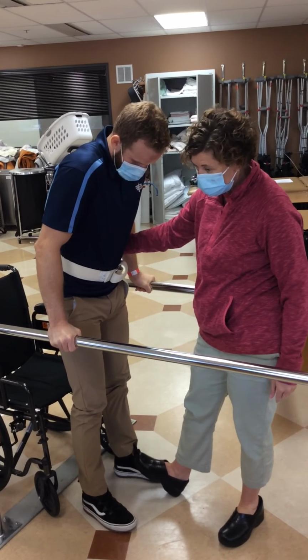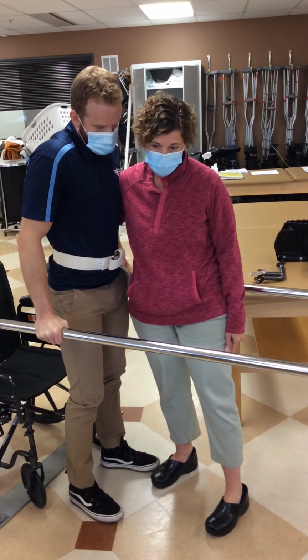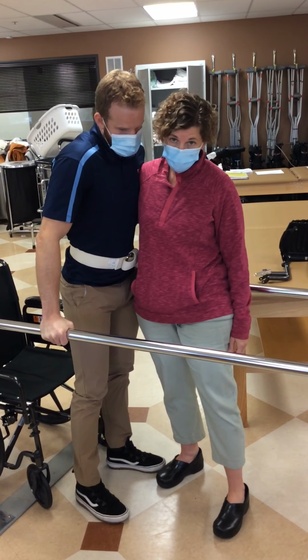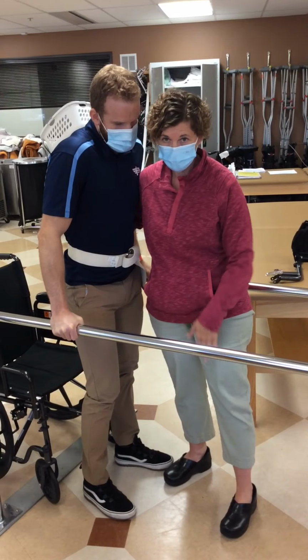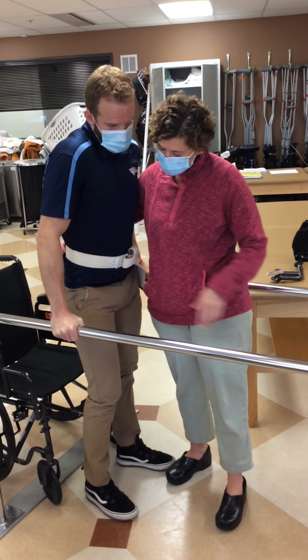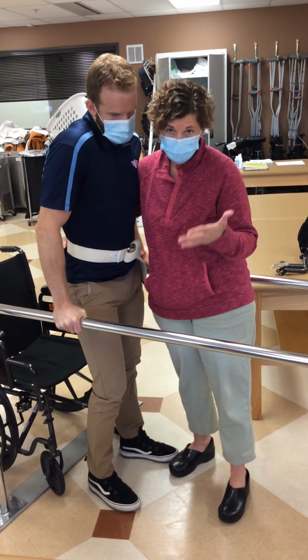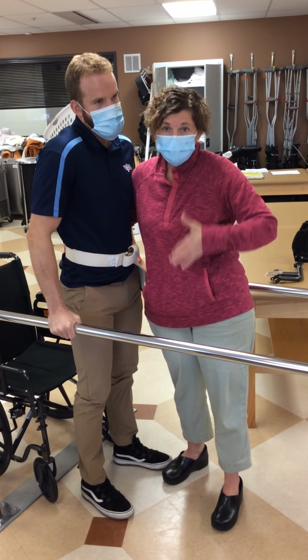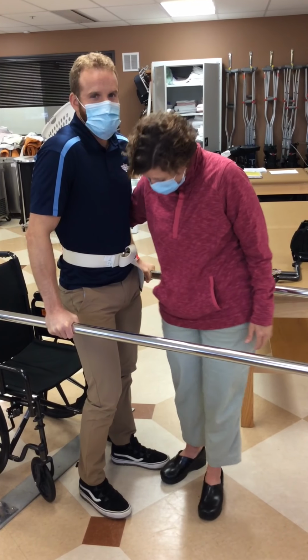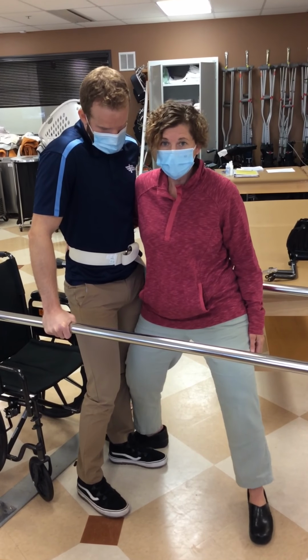Okay. And what I can do is either stand on the strong side, if I want to make sure that if he loses his balance, I can support him on that strong side, or I can stand on the affected side. And I'm changing my mind. We're making the right leg affected so you can still see me and you don't have to look at my backside for the whole video. So if I wanted to, I could stand on the unaffected side so I could help support him if he loses his balance. And I would do that in the earlier stages of rehab. Once he's confident and can do pretty fair support, then I can move on to the affected side to encourage that weight bearing with gait.